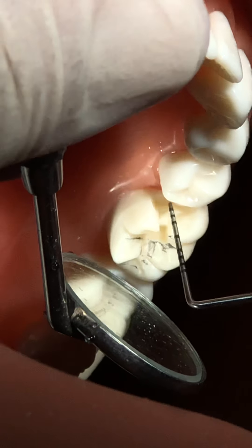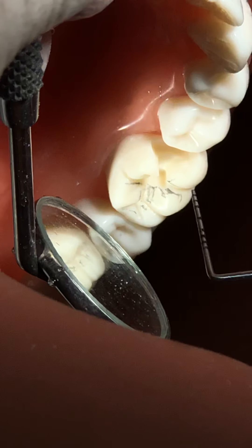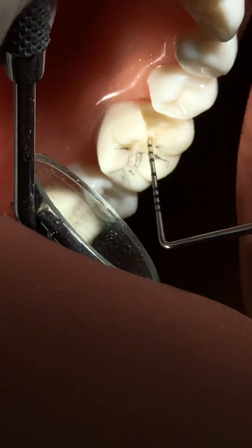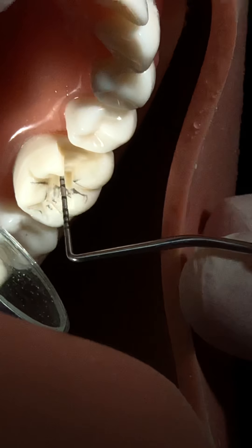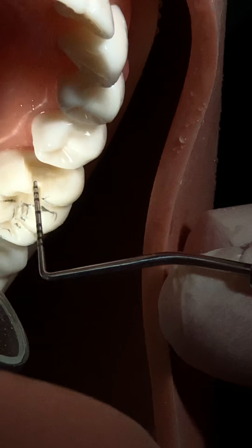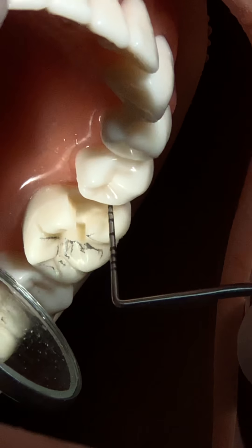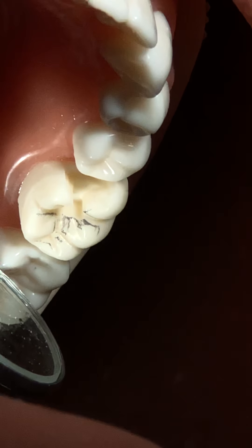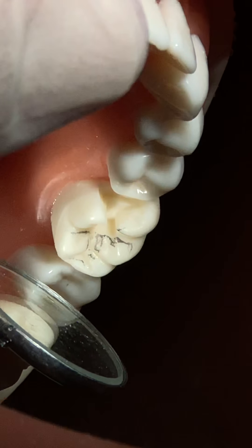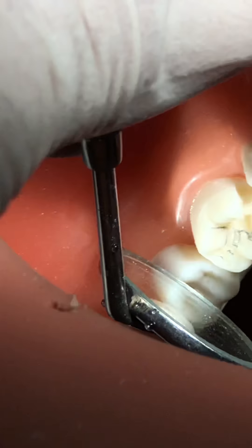It's deeper now - almost 1 millimeter inside the gingival floor. The dimension is 1 to 1.5 millimeters. Check the walls for any sharp edges or rough margins and remove them. The pulpal floor is steady at almost 1.5 to 2 millimeters. The axial wall is slightly tilted in an arc shape and the gingival floor is straight. This gingival floor is not so deep that it goes into the radicular dentin.